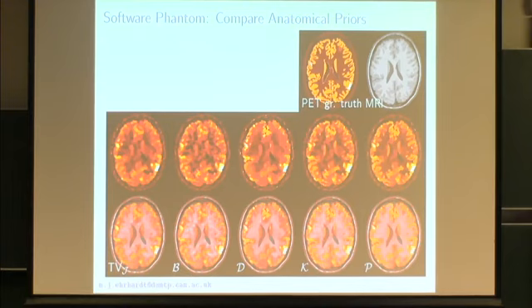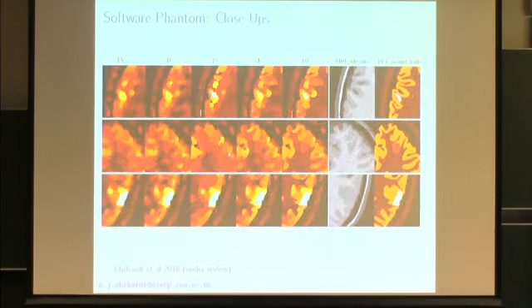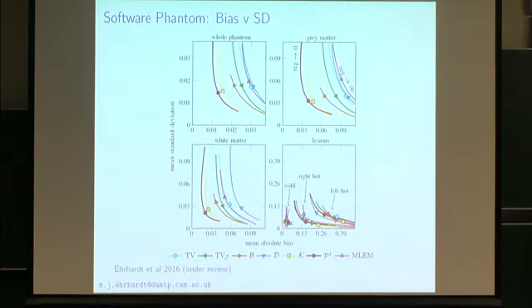One thing that is maybe worth noting is that this prior, where the sign of the MR plays a role, is not able to reconstruct the gray to white matter boundary, as in this example the MR and PET are negatively correlated. In MR we have a step up, while in PET we have a step down. This prior doesn't allow it, so we get rubbish here. Maybe let's skip this one.